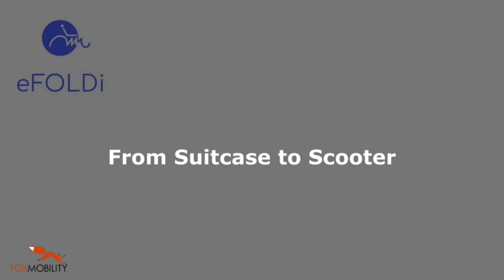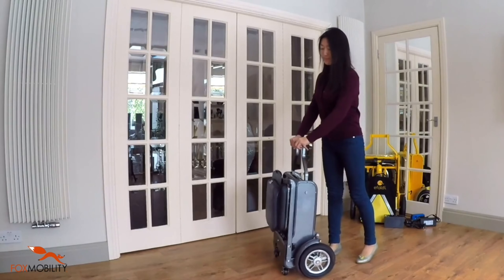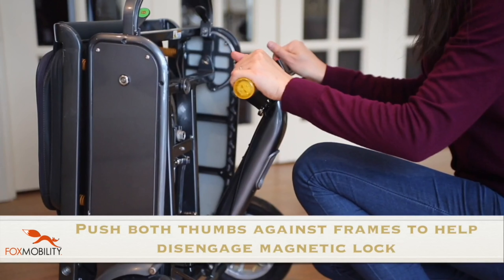Folding the eFoldie from a suitcase to a scooter. Before folding, please ensure the eFoldie is positioned on a level floor. Use both hands to release the handlebar and pull the handlebar towards you to release the magnetic lock.